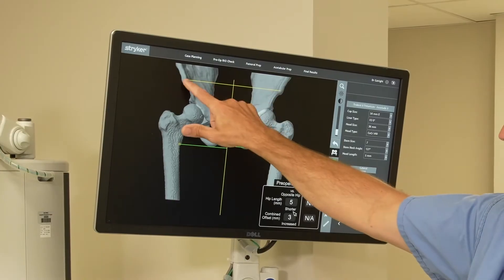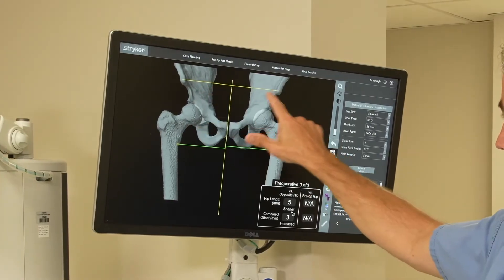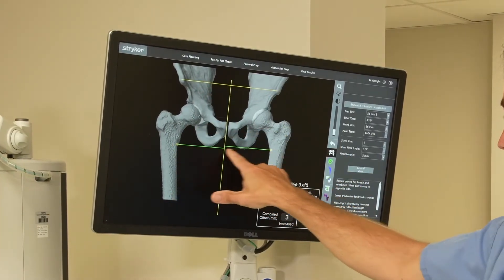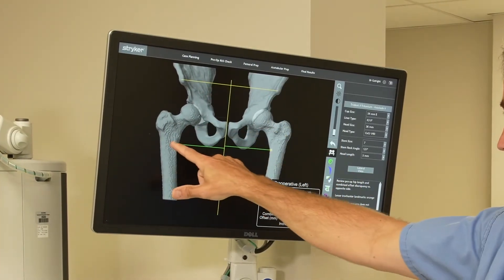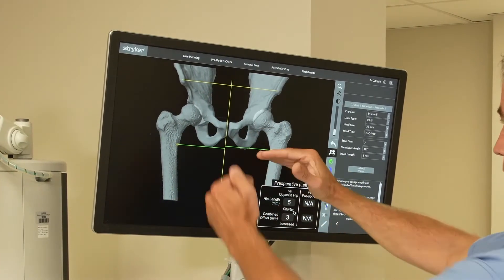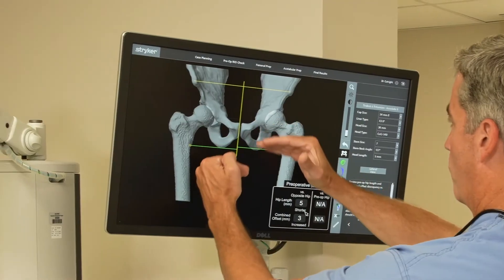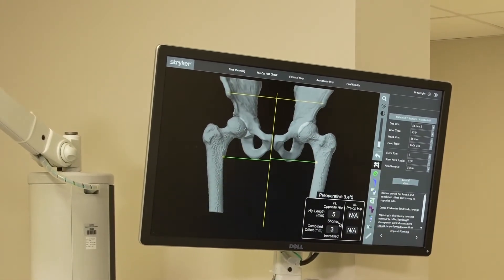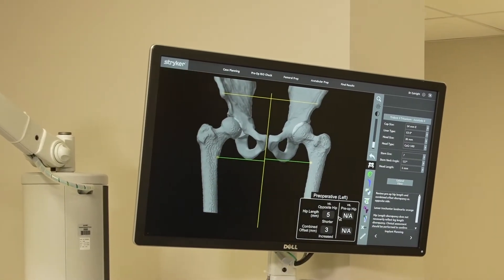So this is a level pelvis, and then we reference off of the same point on the femur. We can tell if one leg's long or one leg's short, and we try to fix that while we're doing the surgery.